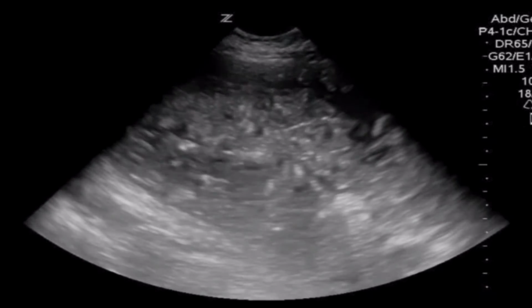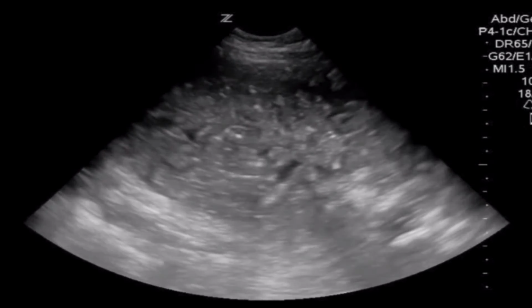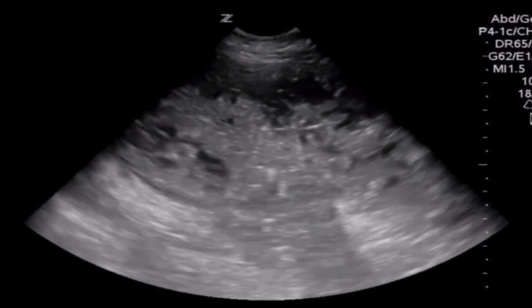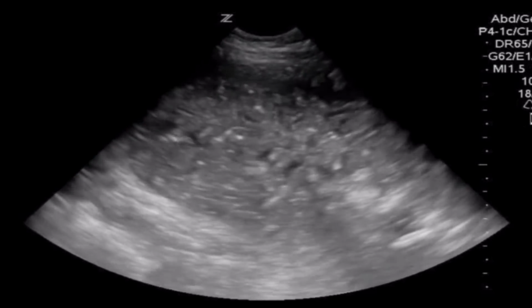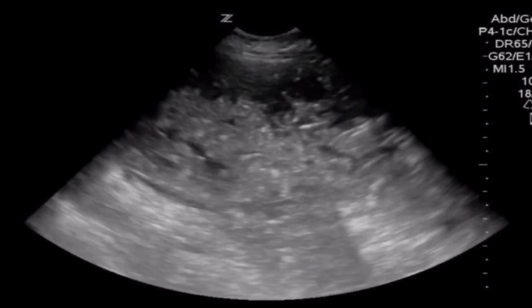You ever wondered what back and forth peristalsis is, or antegrade retrograde peristalsis? Here it is. It is literally stool contents moving up through the bowel and then heading right back down because there's just nowhere for that stool to go as the patient is obstructed. It is also colorfully referred to as a poop waterfall.